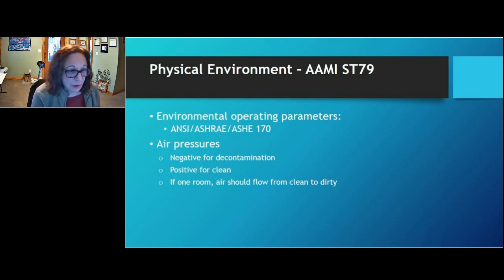And I know sometimes it's difficult. So you want to talk to facilities management or your facility manager if you're trying to set up a sterilization area, so that you know where to place things for the unidirectional workflow. So at least you can get airflow from clean to dirty.